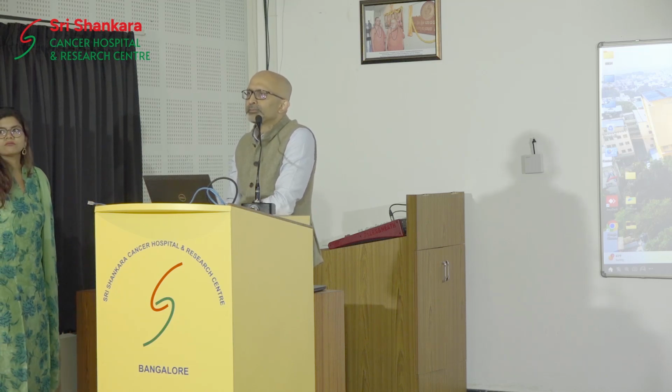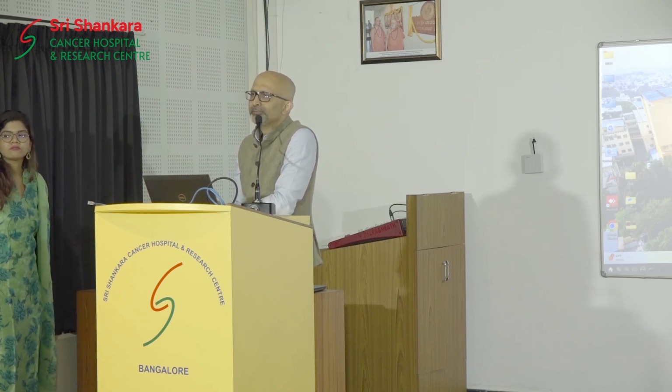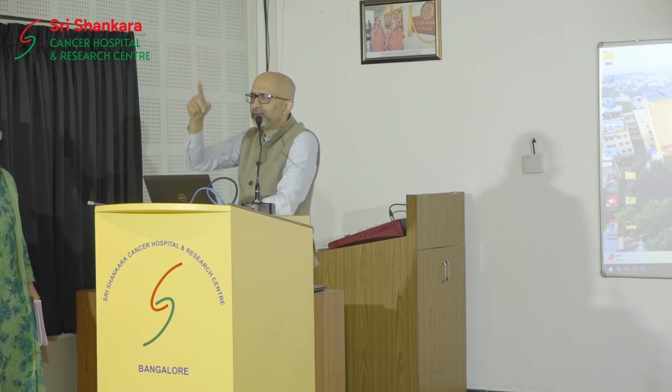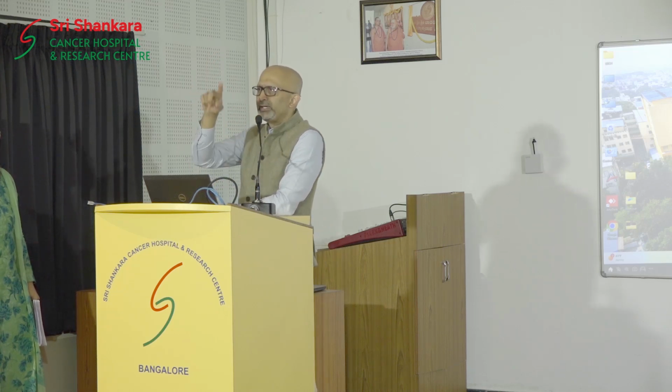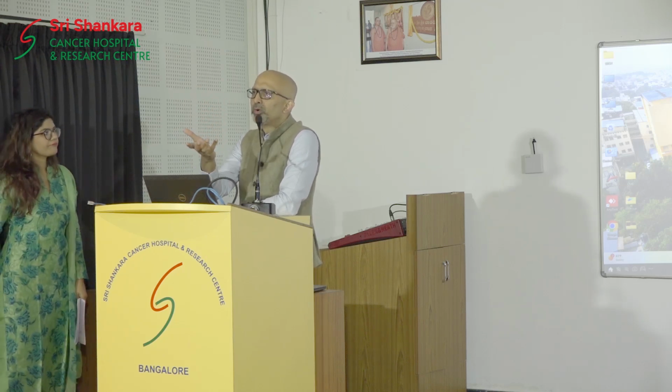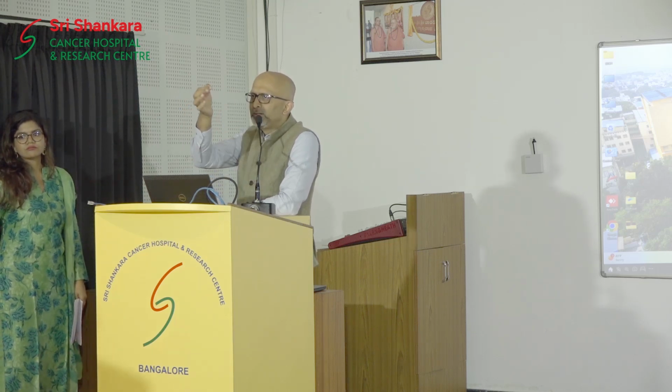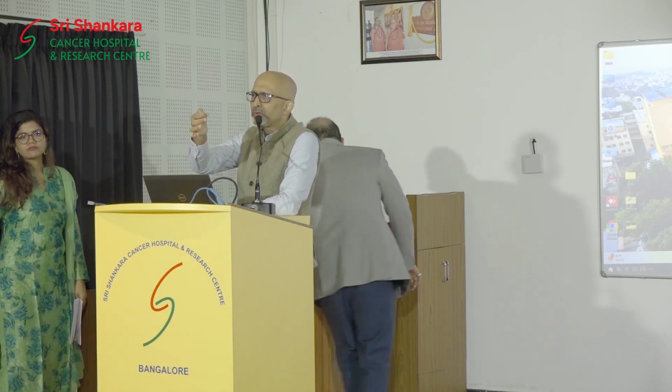Sir, and one more thing, the case which you had shown regarding thyroglossal cyst. Is there any issue if you go till the base of tongue, excise the part, and then? We can do it. So, regarding the carbon dioxide leak, if you are going up to the base of tongue, only the last part, right? You would have finished the surgery, but we have not done that entire tract you are talking about. Yes, coring of the tract. But if you see the tract clearly, that's when you can really core it. Otherwise, what are you going to core? So if we see it, we can core it, it's not a problem. Up to skin, up to the mucosa, it's possible to core.